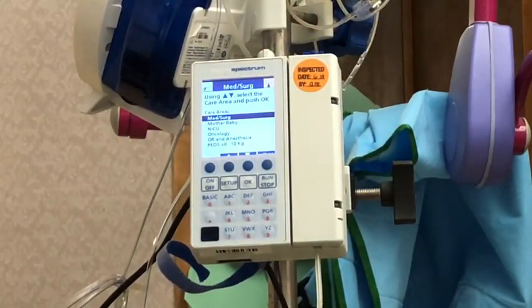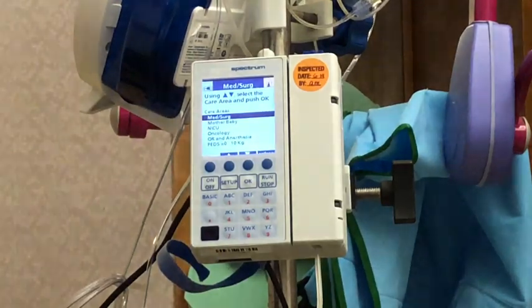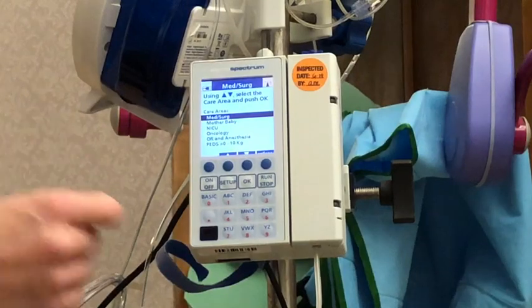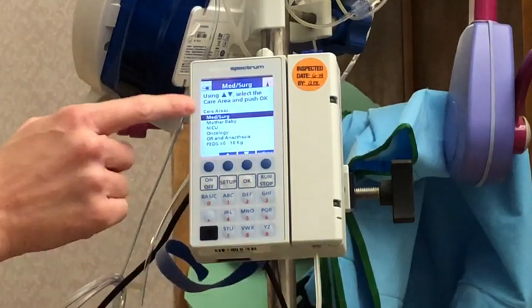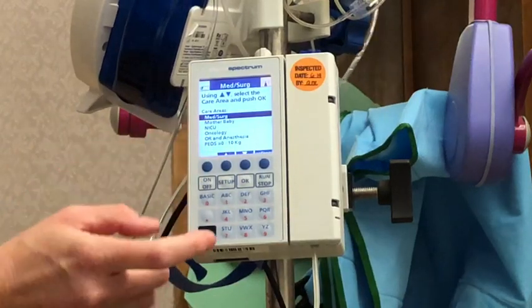Now we're going to select our care area. The care area should always coordinate with the area that you're working in, so I'm going to hit Med-Surg. You can use these soft keys to move up and down to select your area.